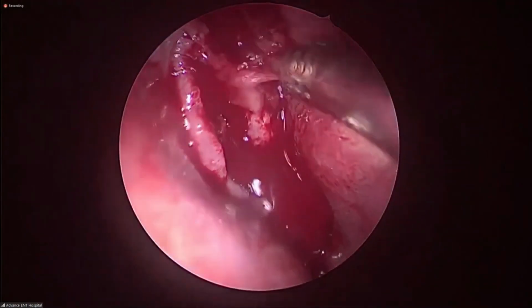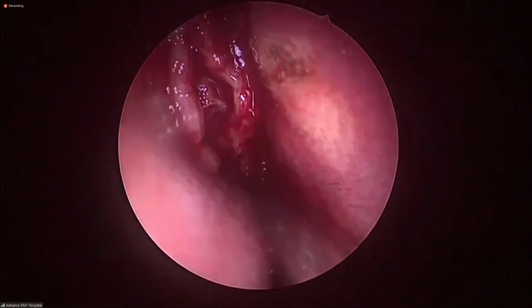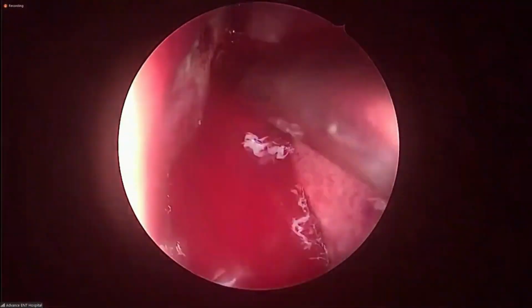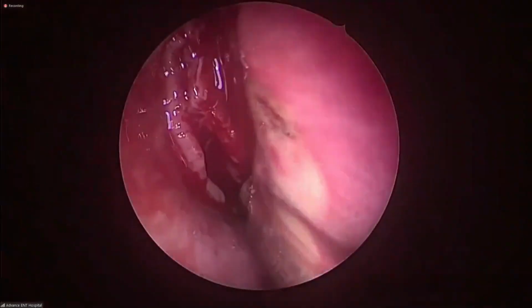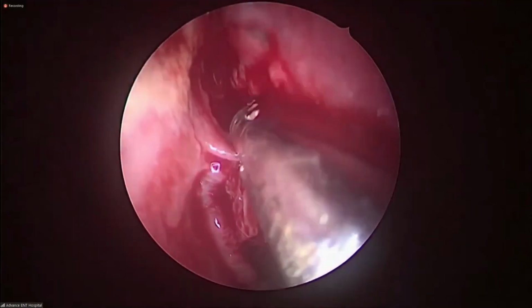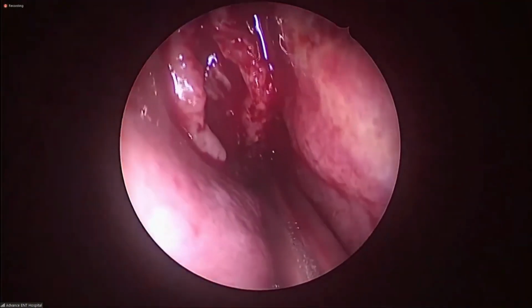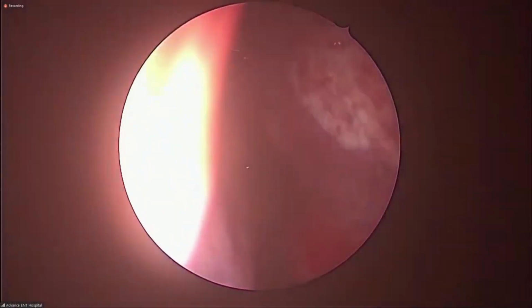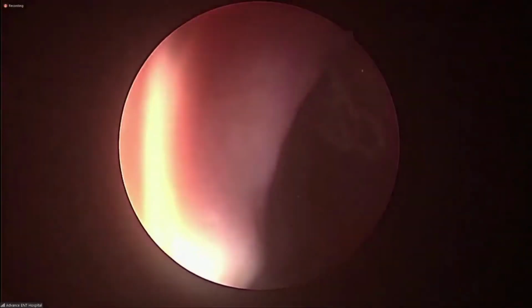That looks like middle turbinate, sir. Yeah, this is middle turbinate only. Yes, sir. See the level of axilla. See this? There is a lot of disease medial to it. Again, I am not going to be very aggressive over that. And this is your uncinate. So things are much clearer now.